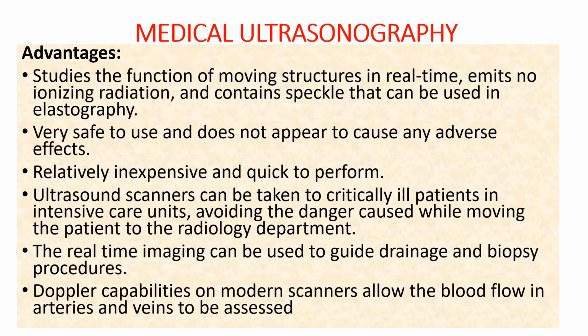Advantages of ultrasonography include the following. It studies function of the moving structures in real time, emits no ionizing radiation, and contains speckle that can be used in elastography. It is very safe to use and does not appear to cause any adverse effects. In fact, there is no reported adverse effect of ultrasound use so far. It is relatively inexpensive compared to other modalities and quick to perform.